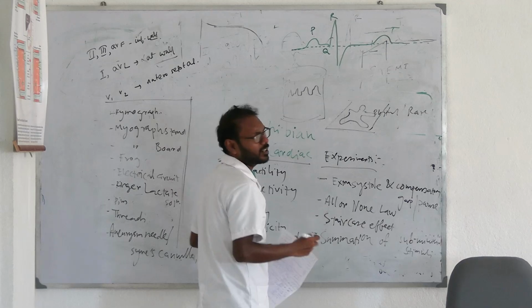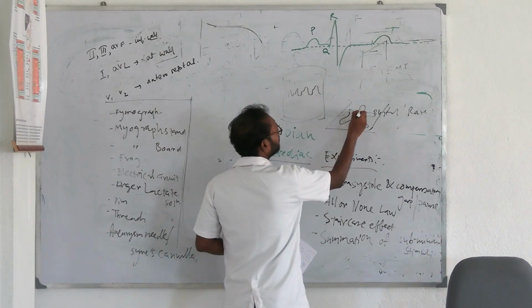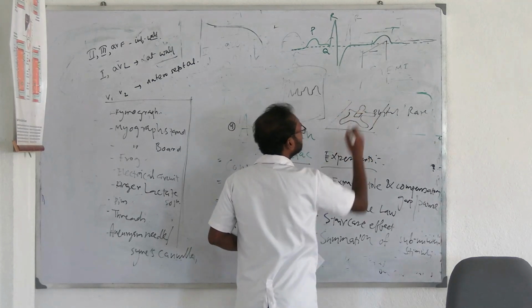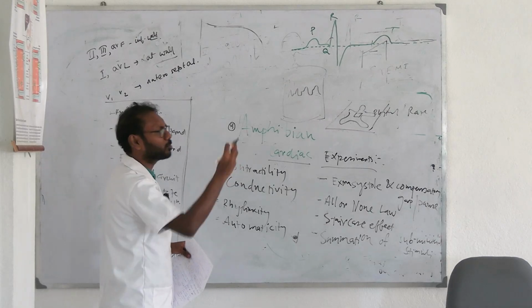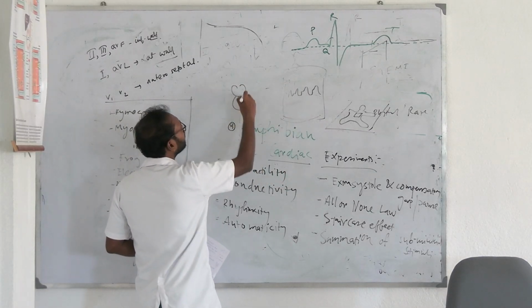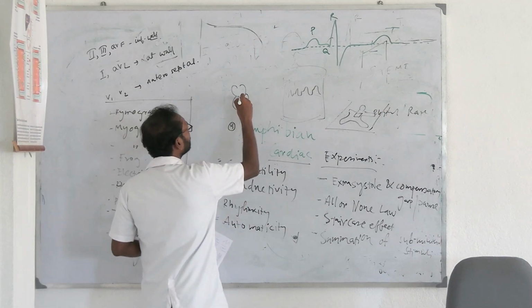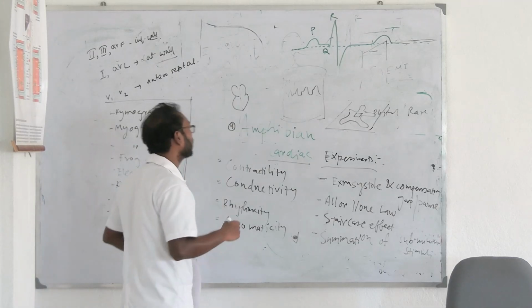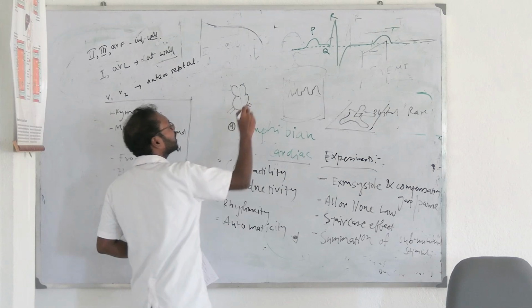The frog is put here with its chest or belly upwards. There will be a window, in this window there is the heart, and the base of the heart is above. Ideally a human heart is like this, with 2 chambers of ventricle and 2 chambers of atria, along with all the veins and arteries coming and going out.